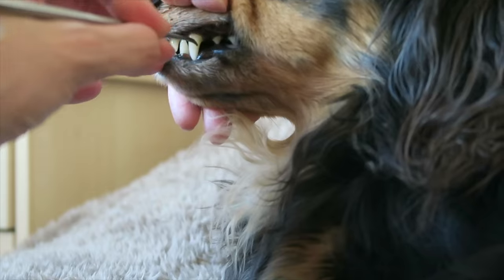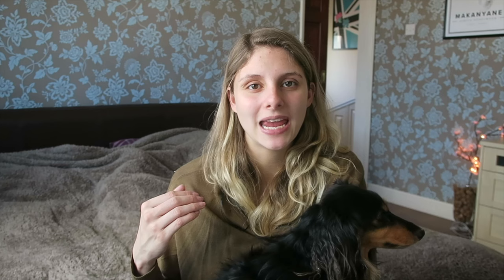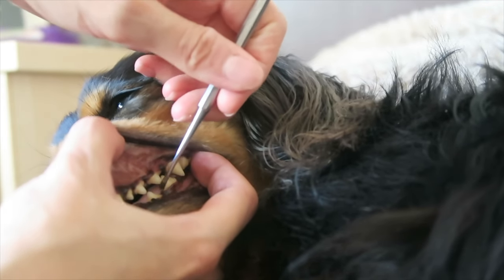You want to work across the top of the gum and do it really gently. As you do it, it might bleed because you're taking tartar and plaque from the top of the gum — so don't worry about it too much. Scrape down but don't scrape too hard because you don't want to bring off any of the enamel. All you're trying to do is bring off the tartar that is there. Scrape along, and even if you don't see any tartar just give it a good scrape just in case, because there might be some building up.